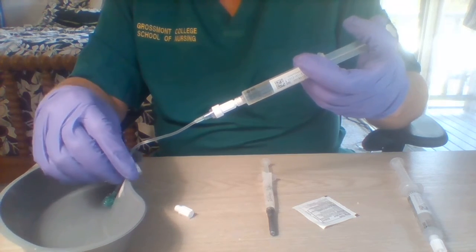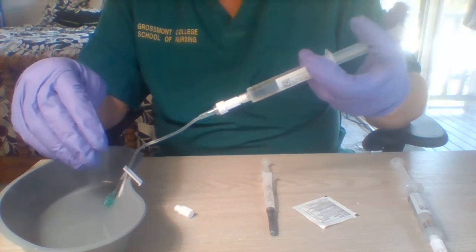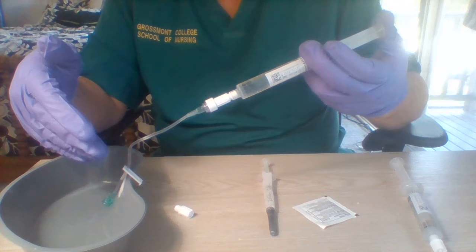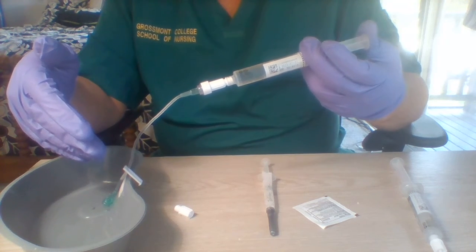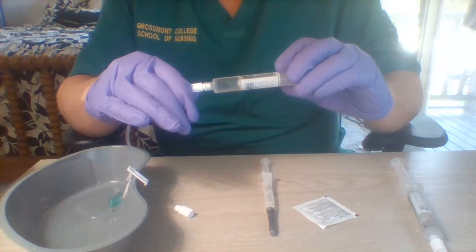After releasing the pinch, I will aspirate slowly. There's blood return. So now I can flush the IV with 5 mLs. There we go.